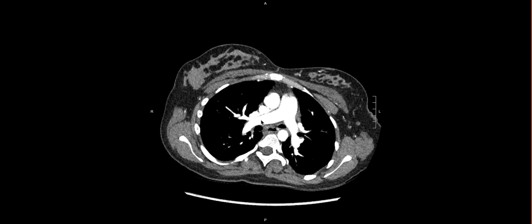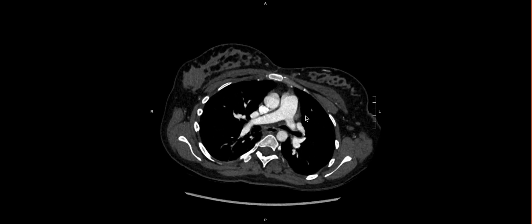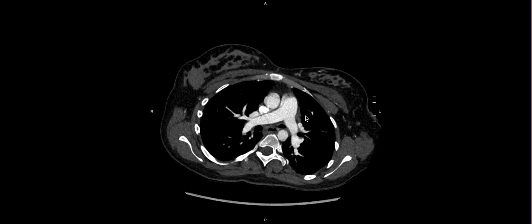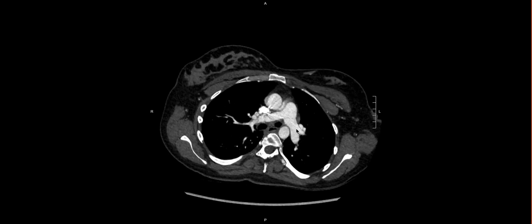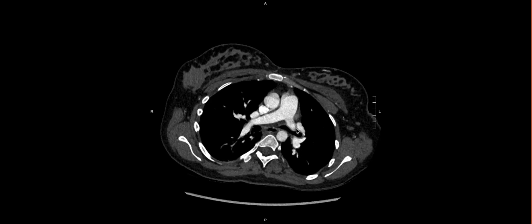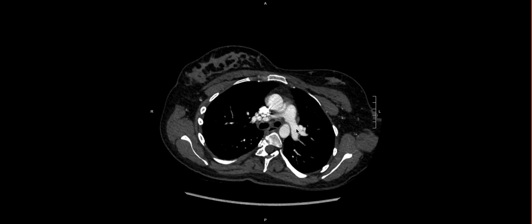It will vary study to study, but oftentimes there can be presets for CTA angiography. That's the preset we have here, which is very similar to how we windowed things manually. So one of the first things to start with is just making sure you window your study appropriately so you can see the filling defects that you're looking for very clearly.